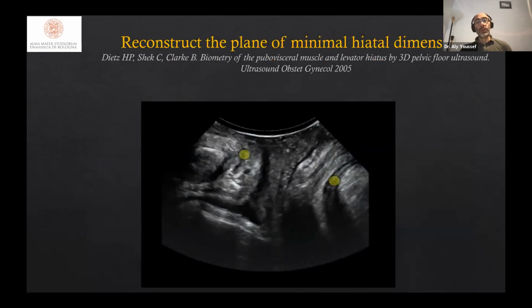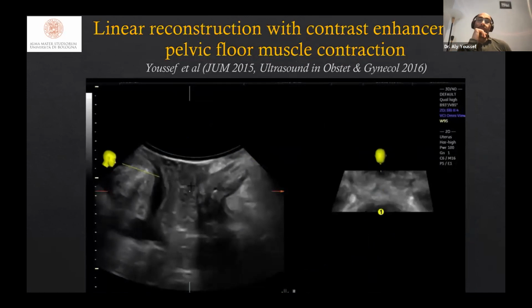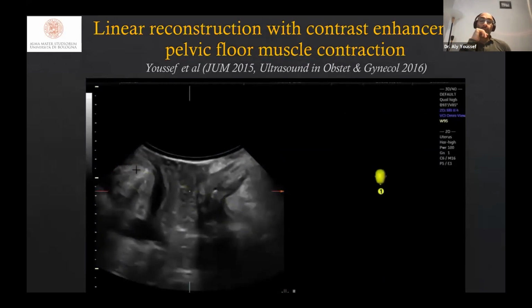So what happens is we just have to trace the plane that we want to reconstruct, and we have an automatic real-time reconstruction and rendering of the pelvic floor structure. Okay.